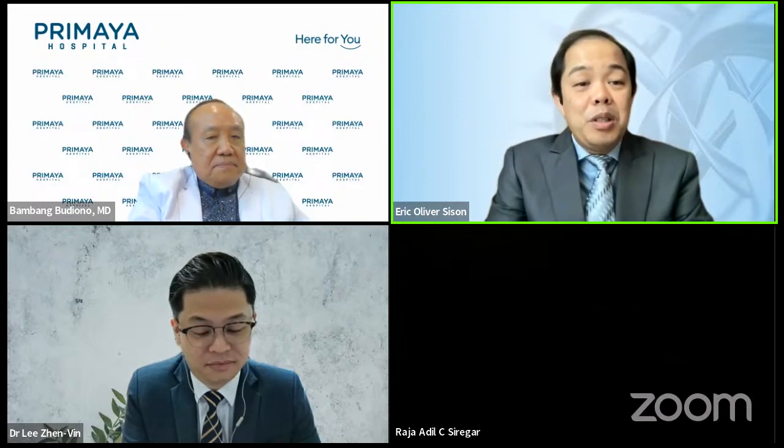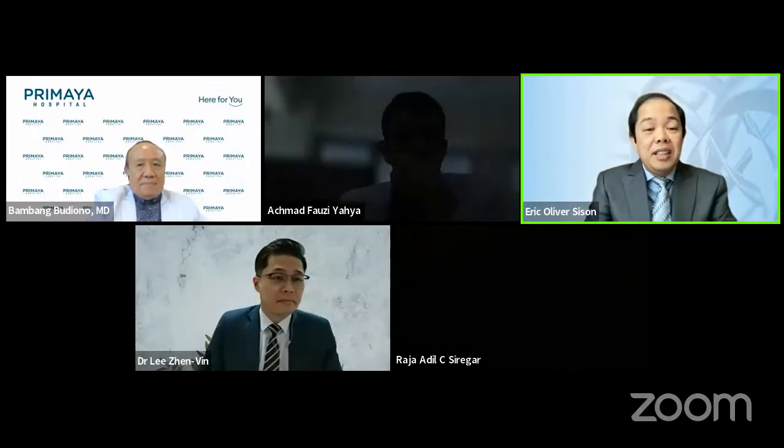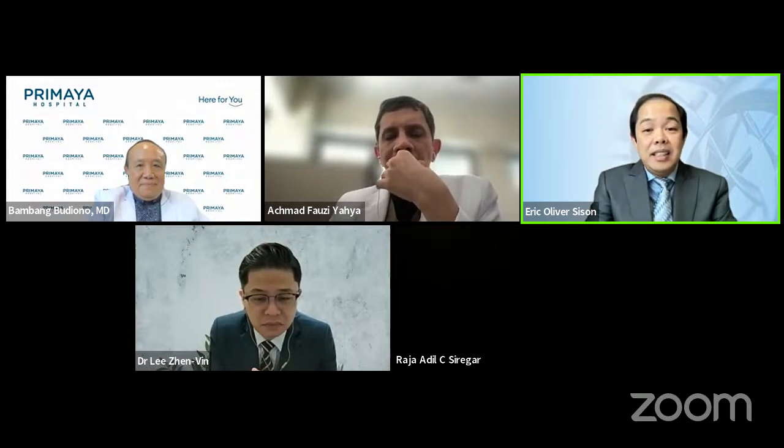I think that's a very good question, because particularly in our setting, we really have to choose wisely which one to use. In ACS, I find intravascular imaging the more useful and more commonly used modality, because most of the time there will be a relatively clear culprit lesion which we need to intervene on, and intravascular ultrasound will help us optimize the result of our PCI. FFR, I don't commonly use in ACS, particularly in the infarct-related vessel. I may use it for a staged procedure, but most of the time I would probably go for intravascular imaging first.